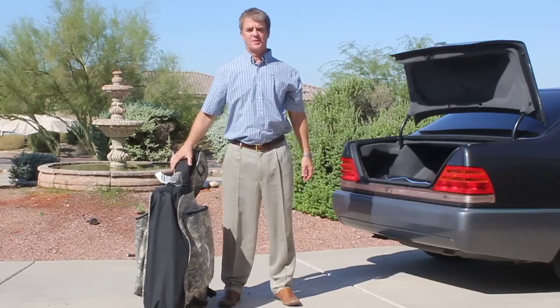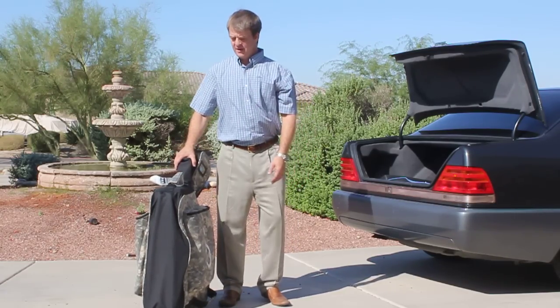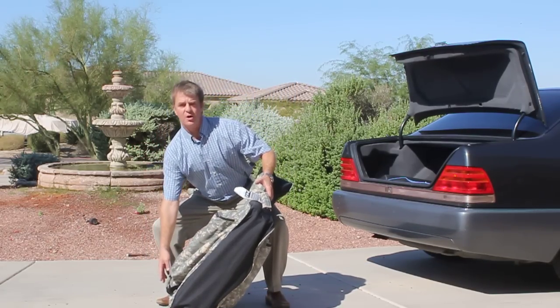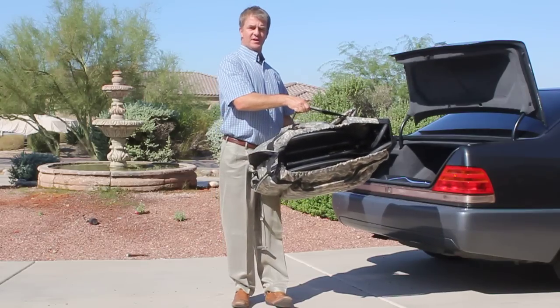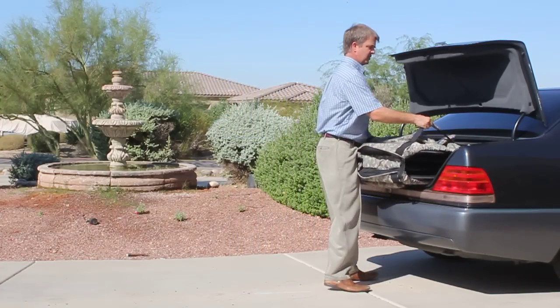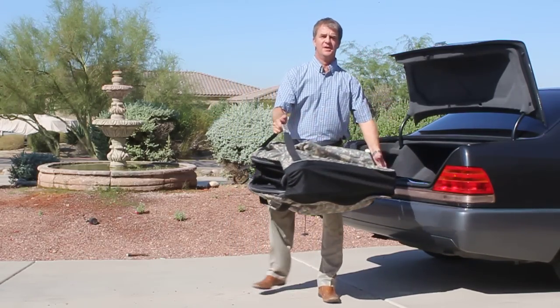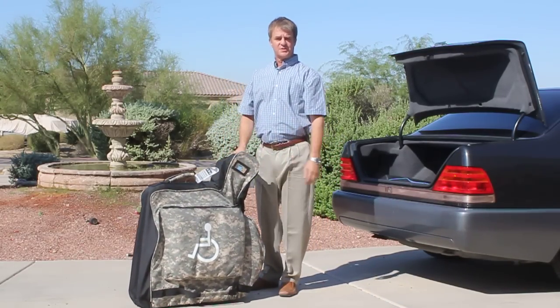The first thing that I put this together for is not to be able to go on the airplanes. That's a wonderful side benefit. What you can now do is, without bending over, with your legs and your arms, you can properly lift the wheelchair. You lift it up, see the bottom, so it's all nice and open. But anyway, there you go. So now you can lift the wheelchair, easily put it into your automobile. Then when you take it back out, you simply bring it back out with your legs, bring it down, release the rope clutches, and it comes right off.